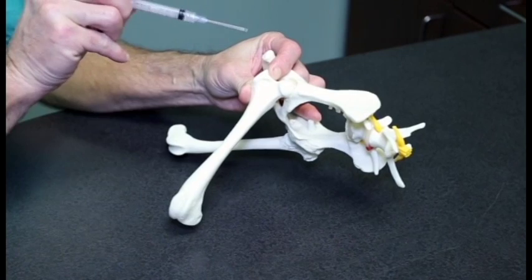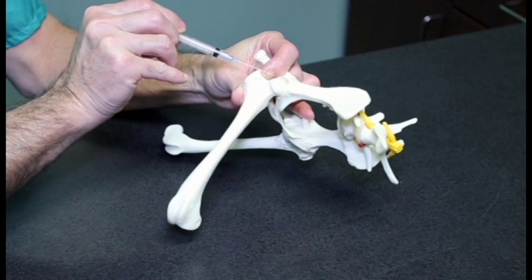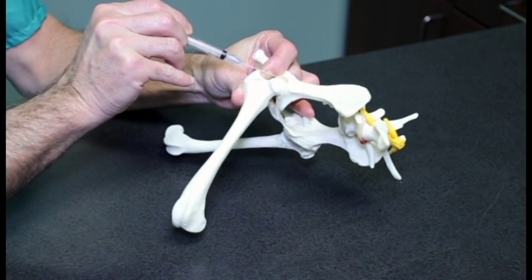The needle is positioned immediately proximal to the greater trochanter and inserted in a slightly distal and ventral direction.